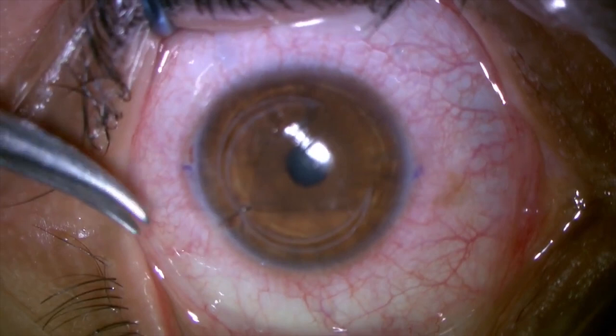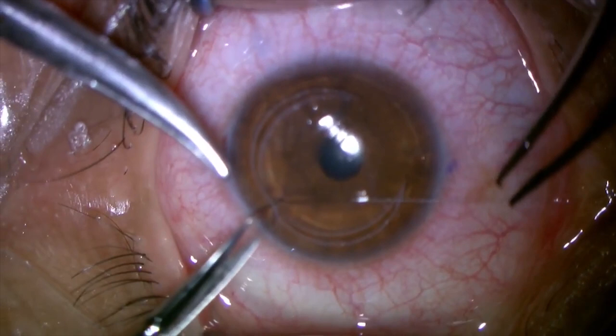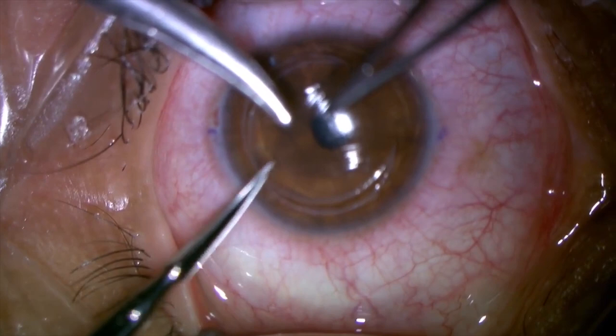So now we're going to do a second stitch.